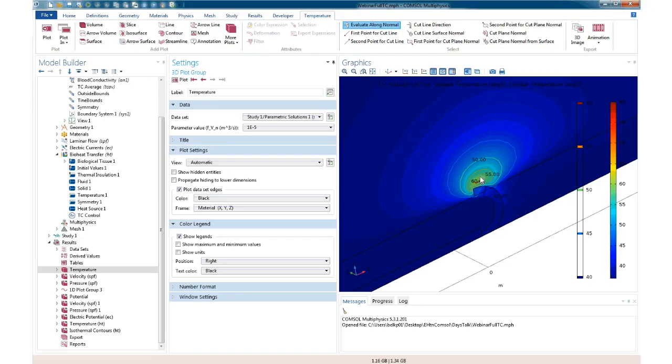So this is where I want to close my part of the demonstration on the value of using simulation in something like a biological system where a lot of times you don't have a great deal of control. The point here is that this was an obvious feedback mechanism. If you're having trouble stabilizing the temperature, measure the temperature and stabilize what you measure. And because of the physiologic variation, we see that it actually works against us.